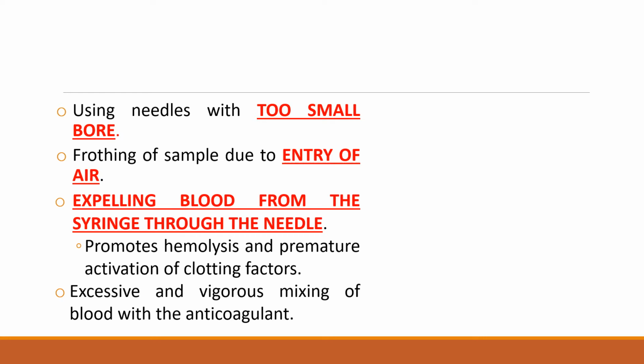The blood collection tube needed for collecting a sample in coagulation testing is your light blue top tube, and the anticoagulant present there is 3.2% sodium citrate. For coagulation studies, if the sample is collected using that tube, the required number of inversions is 3 to 4 gentle full inversions. It says gentle, so please do not agitate your tube vigorously after collecting your sample, because again, that would also promote activation of your coagulation cascade.